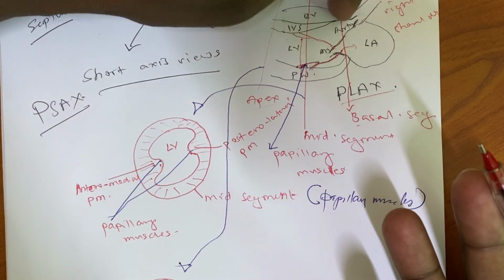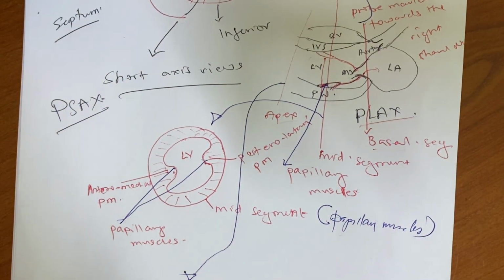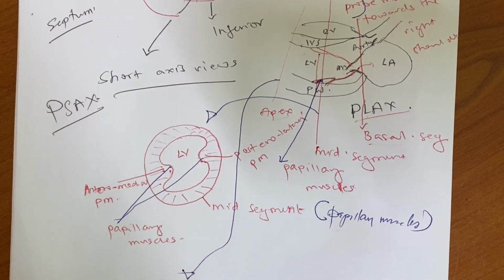Why do I save it? To give a first impression. Only by seeing this one, I can tell, okay, this patient is likely to have a normal study. That's why I save it without applying anything.